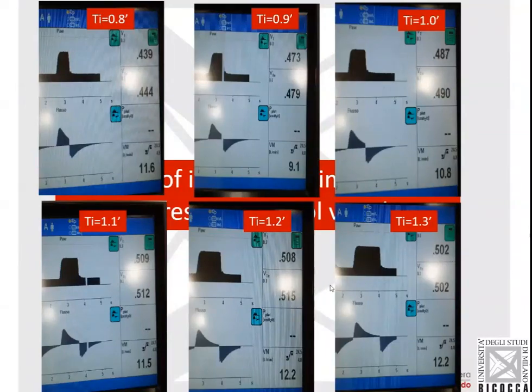Why is that? Because we are not giving enough time for the patient to exhale. And so basically, the patient is trapping some gas. And the pressure gradient between the ventilator and the alveoli is getting smaller because there is still some gas in the alveoli. So the ventilator already finds a pressure when it is starting to deliver the flow.